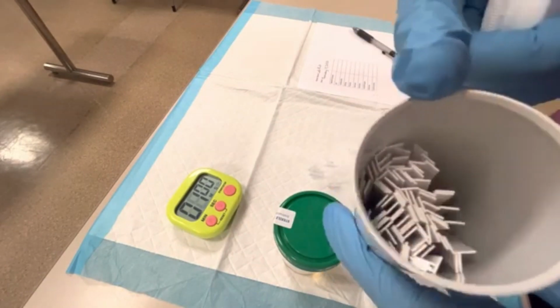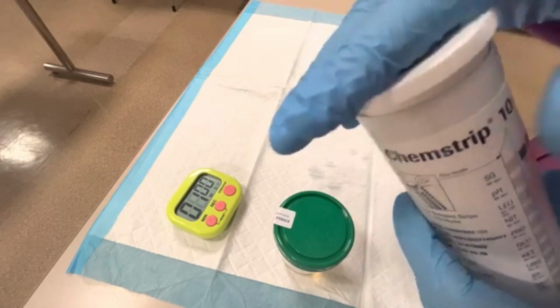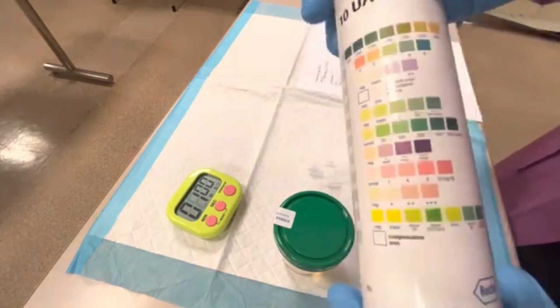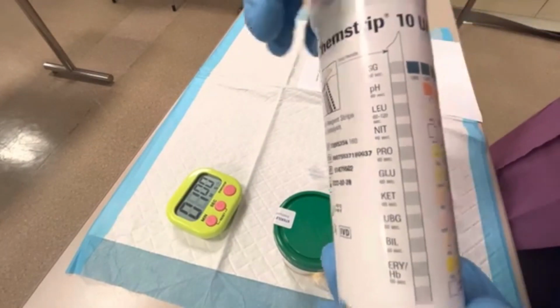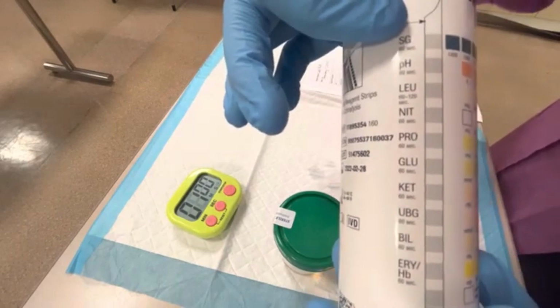You want to keep these dry and away from moisture. And also, before you start this test, you want to check the expiration date as well. And if any of the pads look kind of funky, get rid of that one and start with a new one. So on the side of this bottle here, it shows you the different reagent pads that we are going to be testing this urine on.